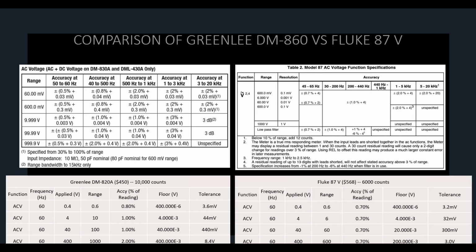So I'll give you guys a great example. Some of you may or may not be familiar with ventilator analyzers out there, but at the end of the day, these companies are out there producing products that they also need to market and sell to you. So I'm not going to put any company's name out there on the spot, but there is a ventilator tester that shows a resolution of 3 decimals, so 0.000 essentially, with an accuracy of 0.05. We have another ventilator analyzer out there who has a resolution of 0.00, so only 2 decimals of resolution, but an accuracy of 0.02.